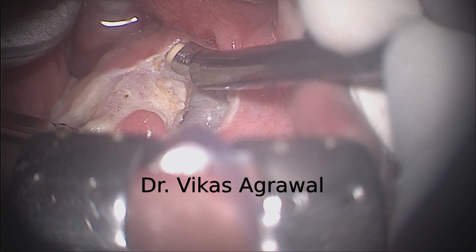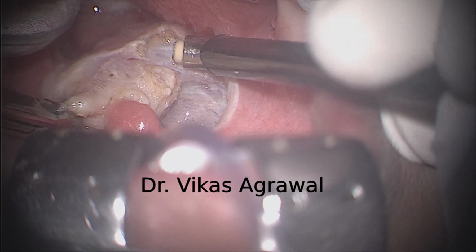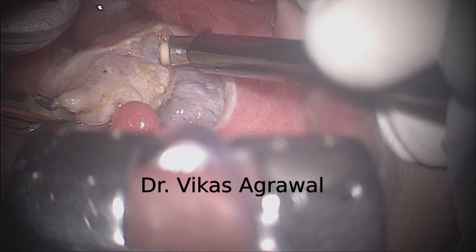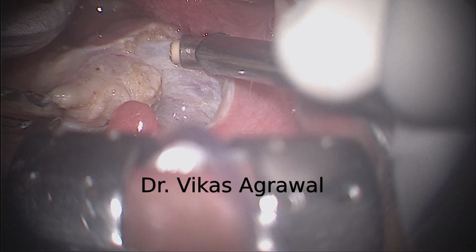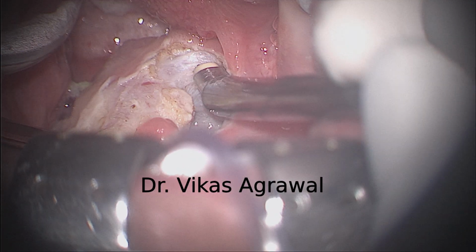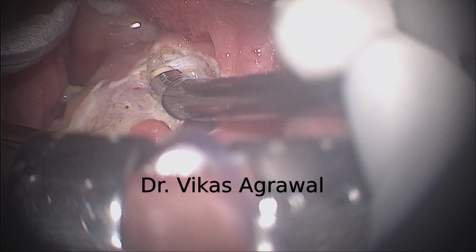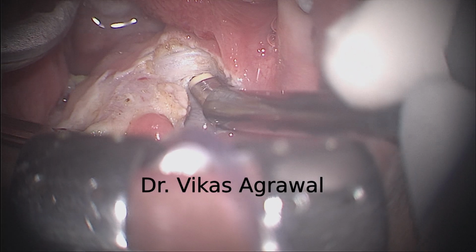So now we will keep our dissection very, very close to the lymphoid tissue and will not enter into the tonsillar artery. The tonsillar artery could be anywhere here.